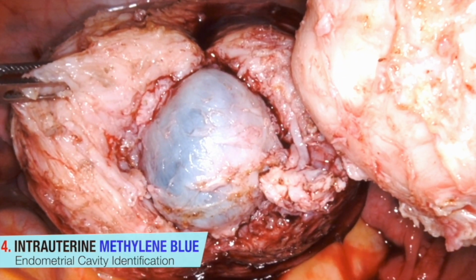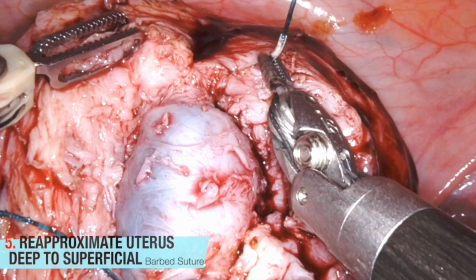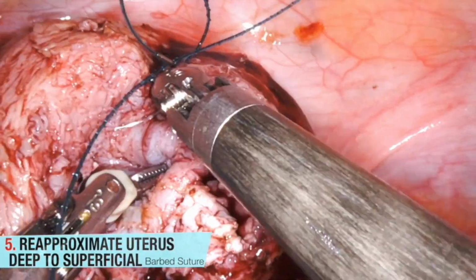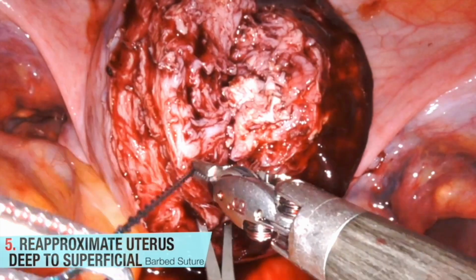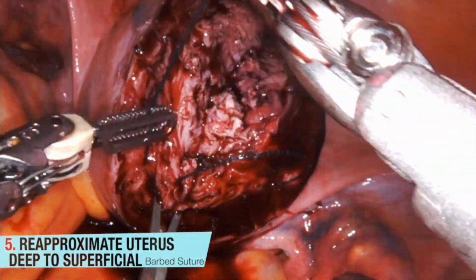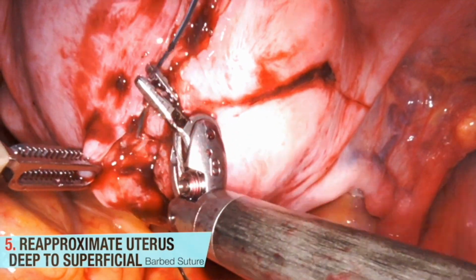A final intrauterine injection of methylene blue is performed to reveal an intact endometrial cavity by lack of methylene blue spillage. In the last step, the myometrium is reapproximated using a barbed suture in a running fashion from the deep to superficial layers. Care is taken to ensure that the suture does not involve the endometrial cavity. The serosa is reapproximated in a running fashion using a baseball stitch.